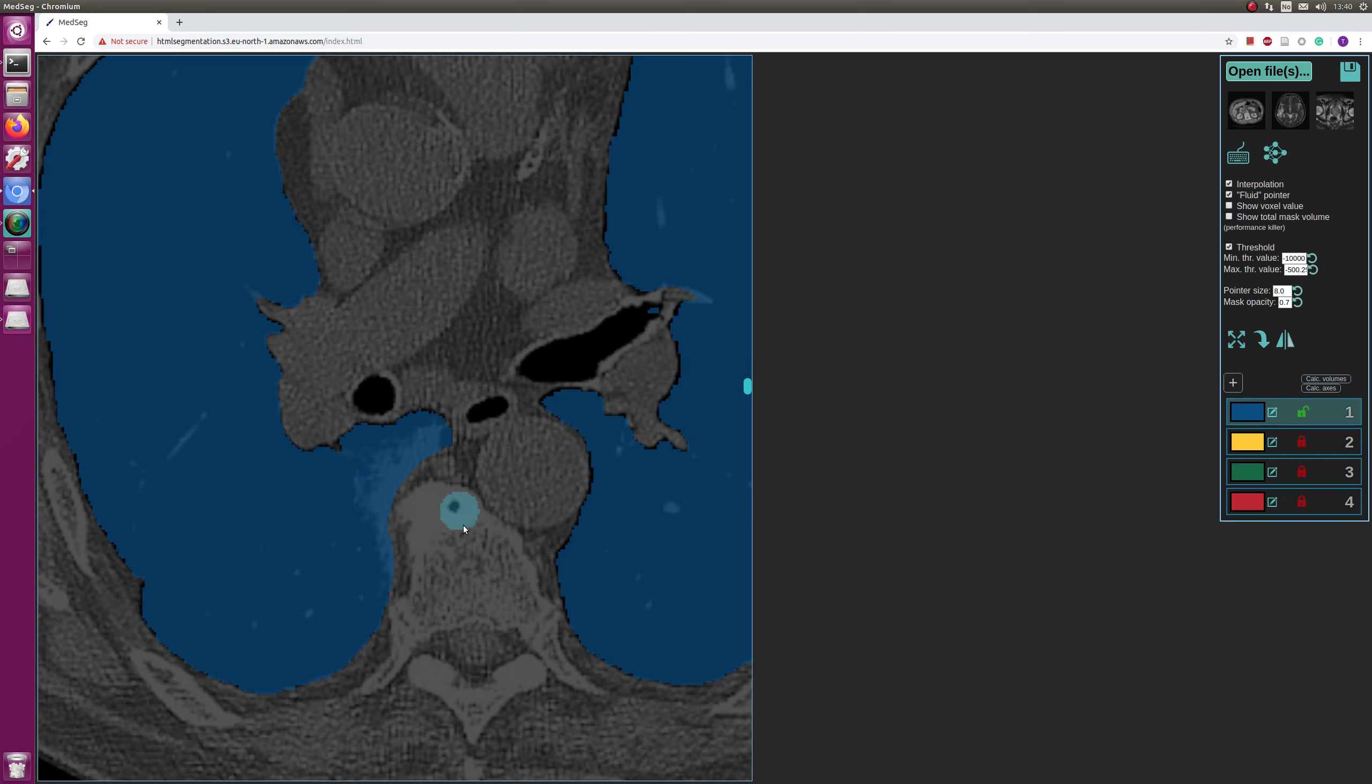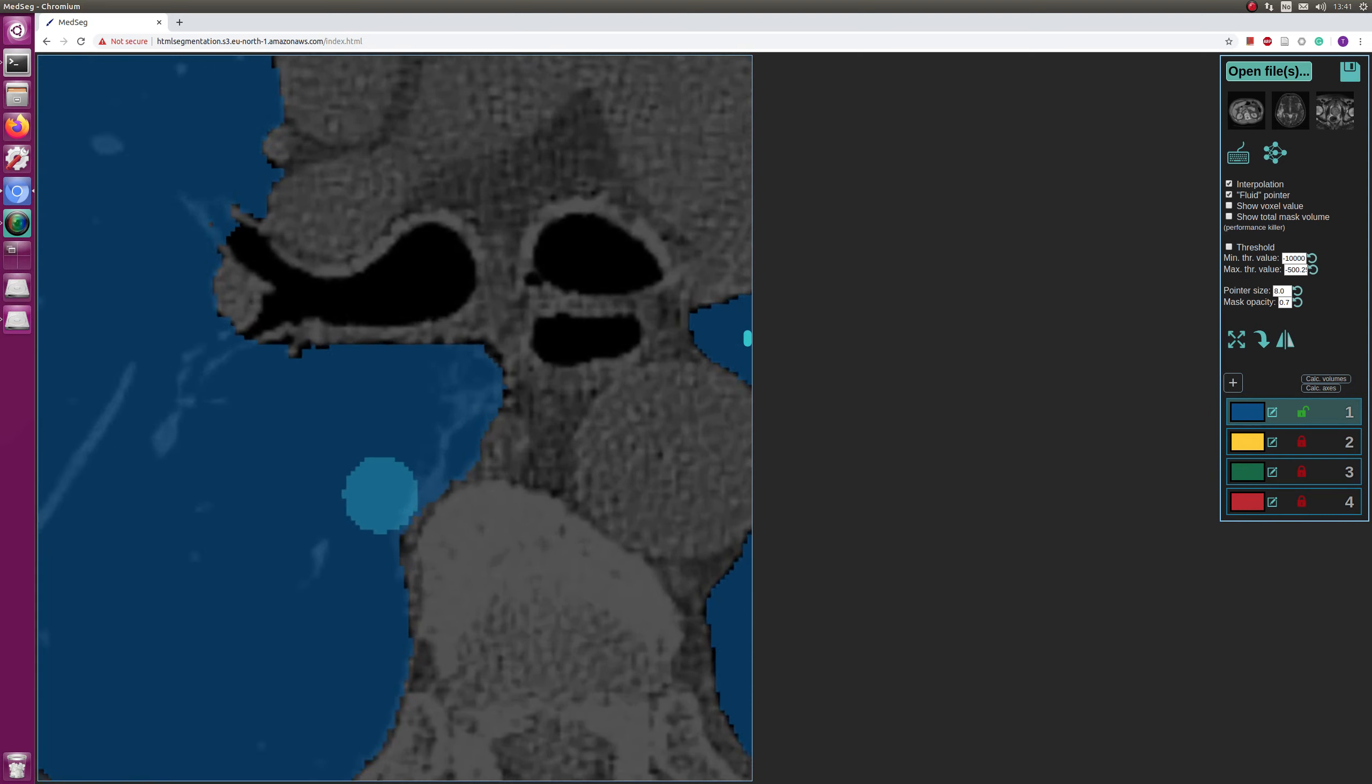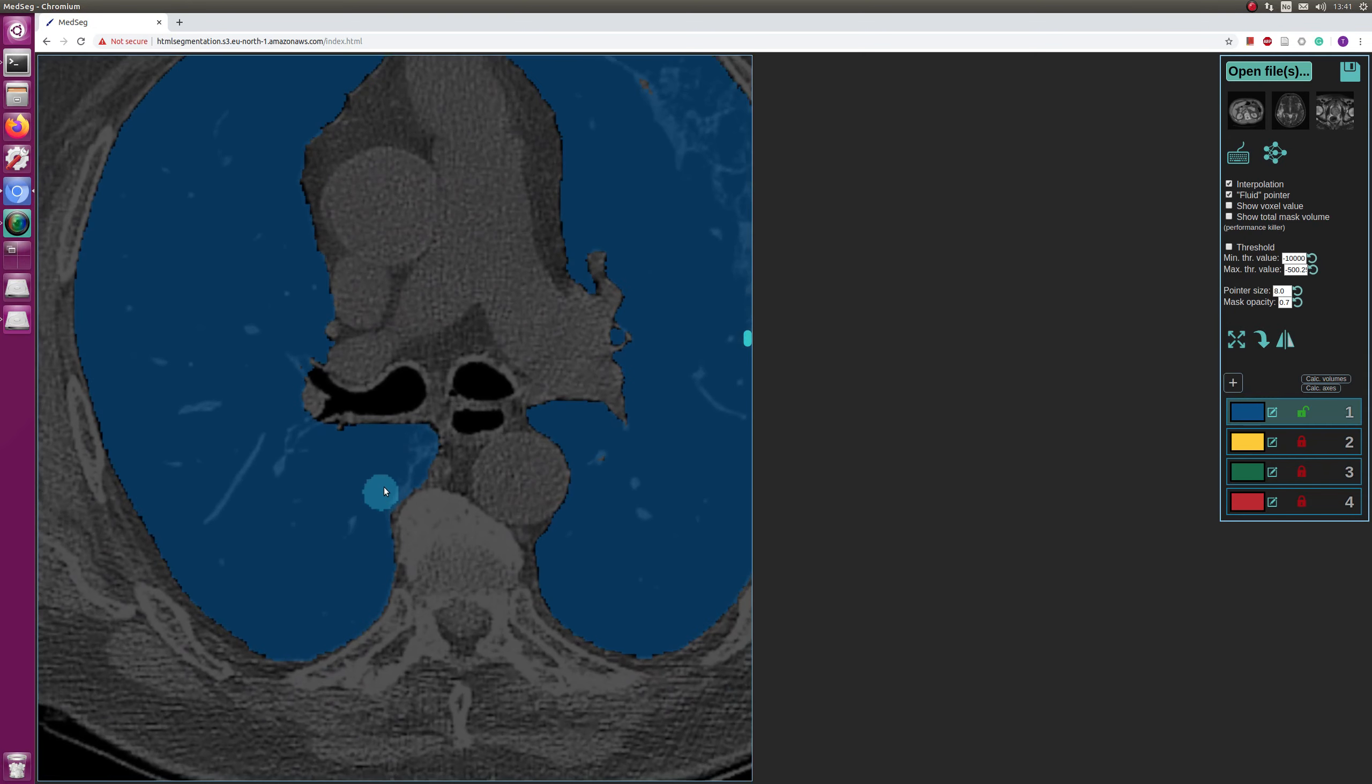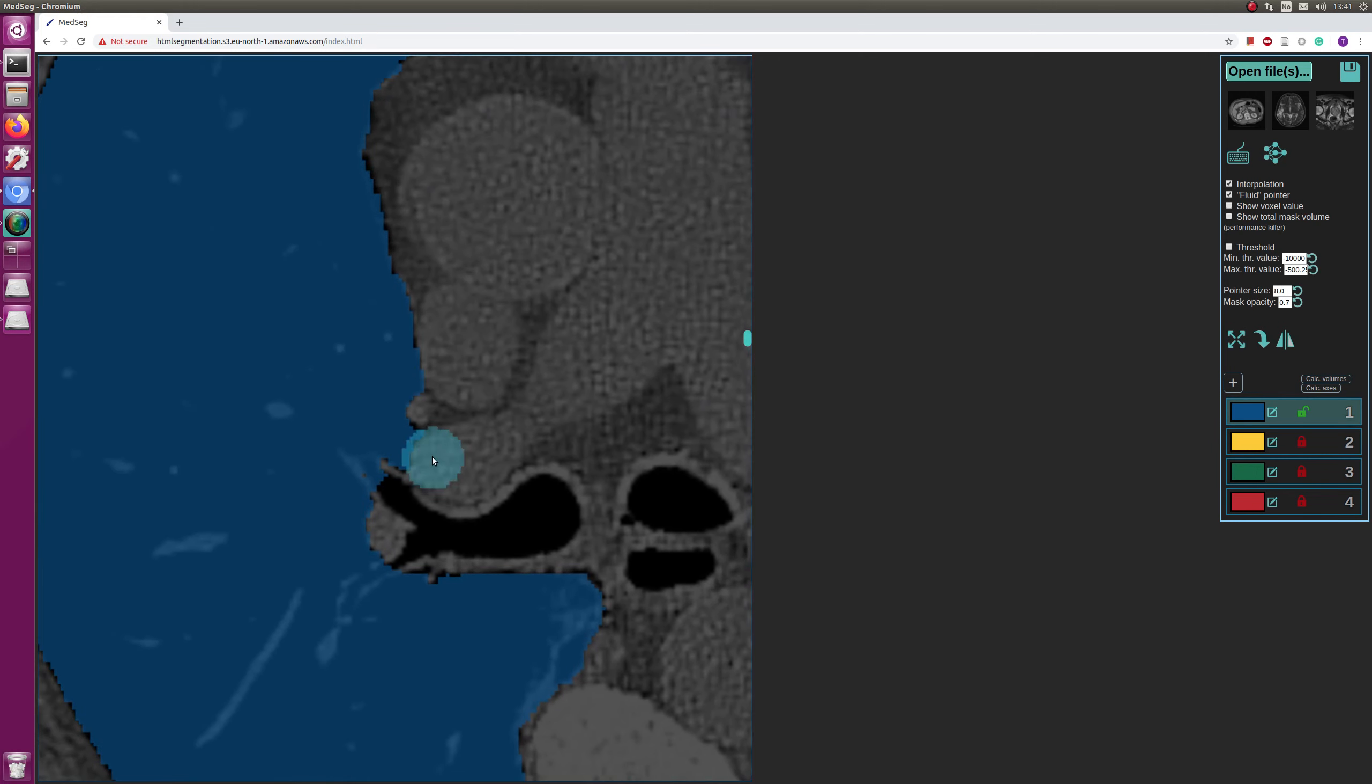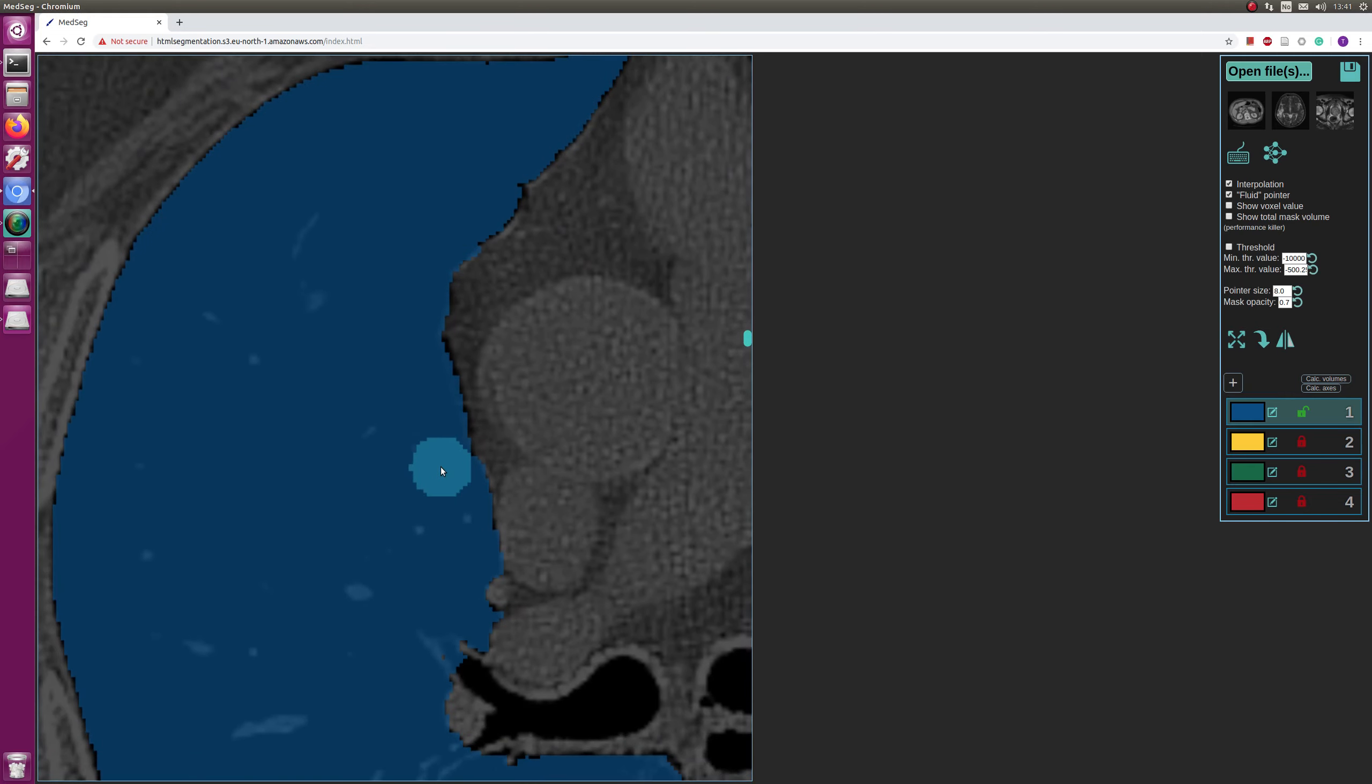And by the way, to zoom in and out, what I do is I hold the Ctrl key button pressed, and then with the right mouse button and move the mouse up and down. Or while holding Ctrl key pressed, you can scroll up and down. And this panning with the left mouse button while holding Ctrl key pressed.